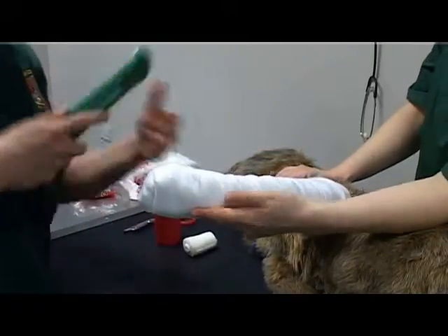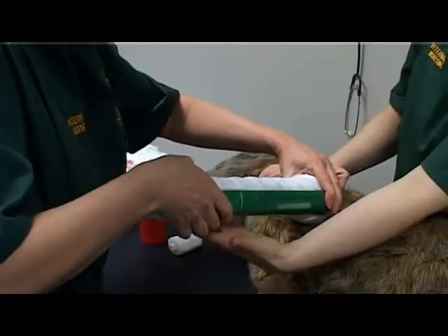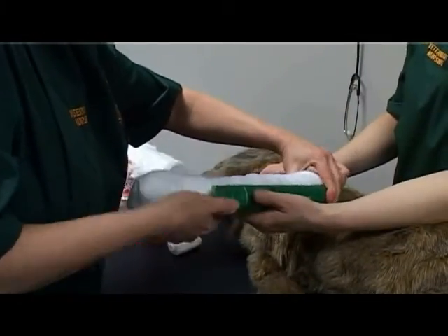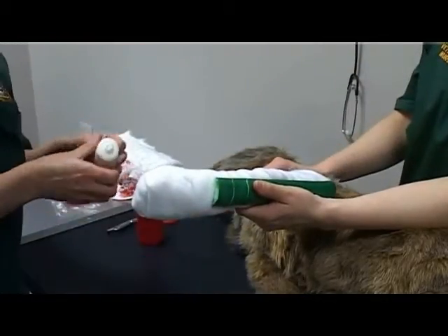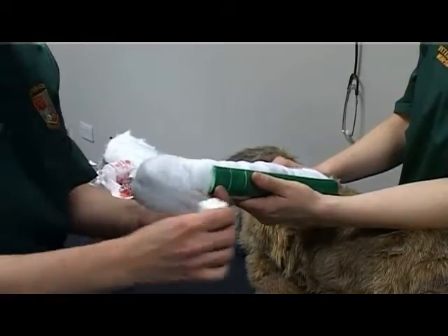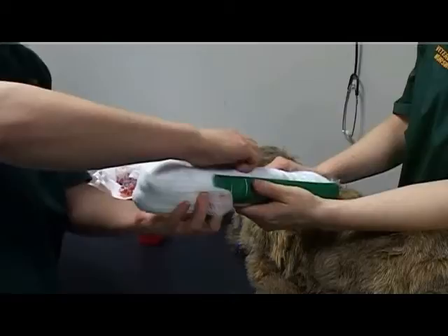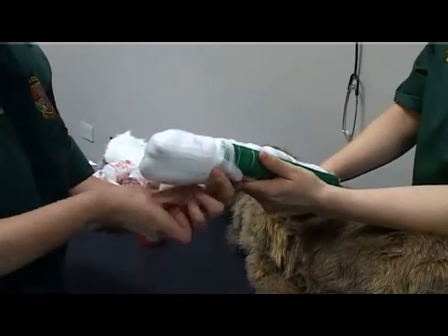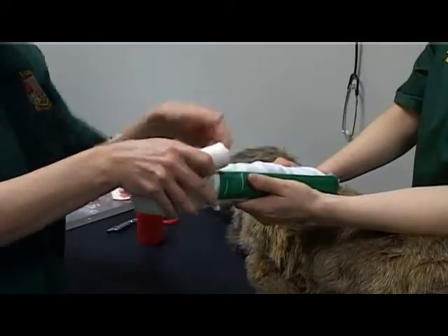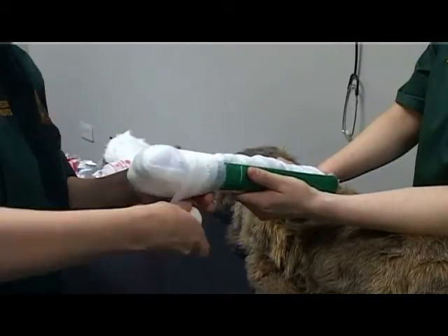Apply the splint to the caudal aspect of the limb, ensuring the splint includes the elbow and the carpus. Apply conforming bandage over the top of the splint using adequate tension, including the foot and elbow. Again, bandage distally to proximally.